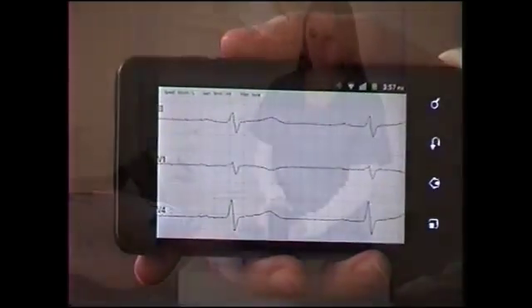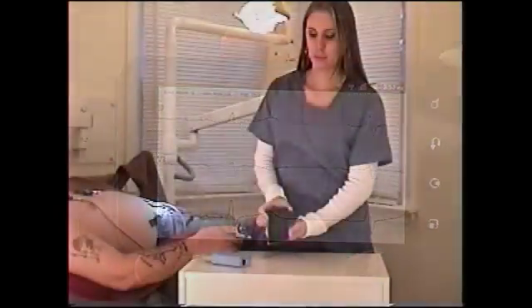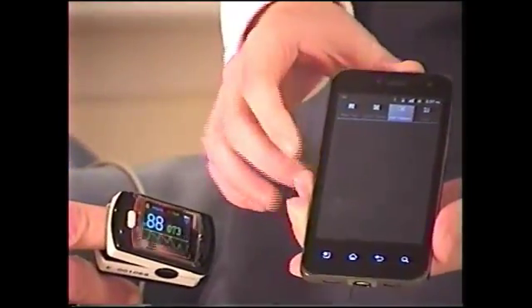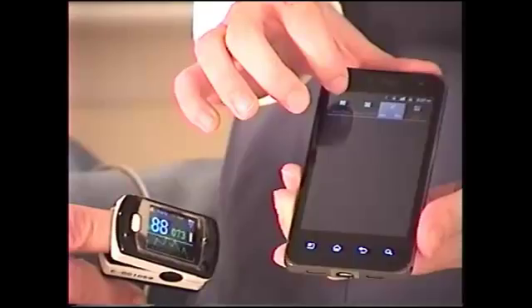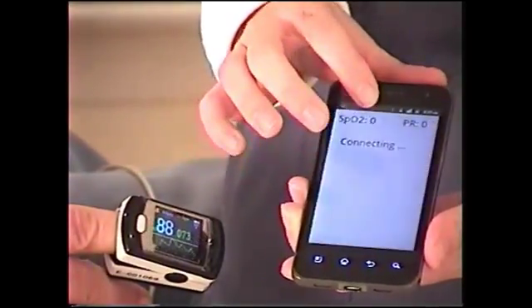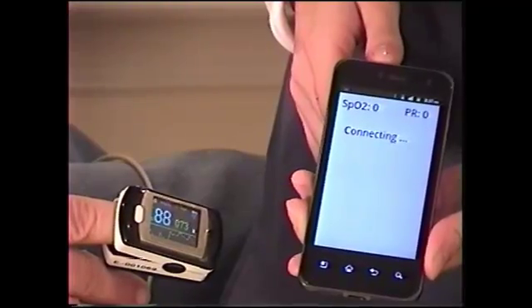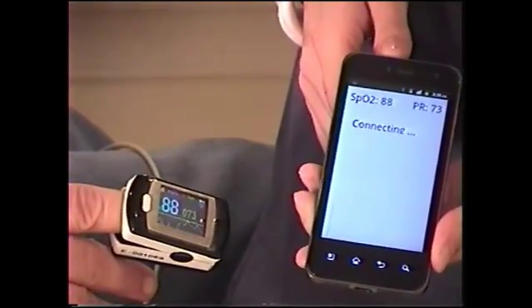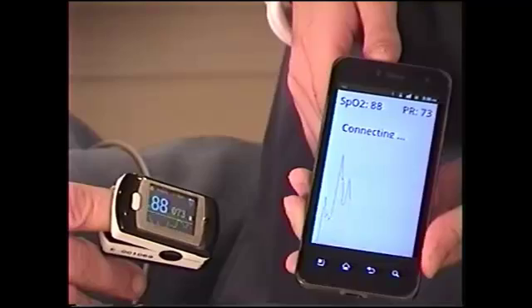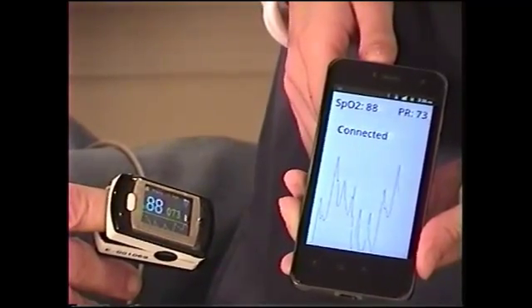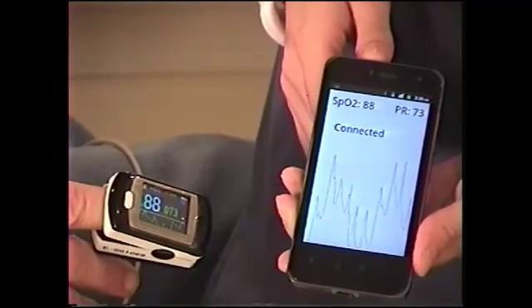The next test we will collect is a wireless SPO2 or pulse oximetry reading. Tap the SPO2 tab to start the test. Verify that the phone is connecting to the SPO2 device. We can see that data is being collected by the SPO2 monitor and also by Cardio Remote. Once complete, we can move on to our next test.